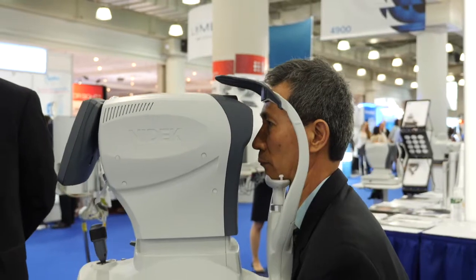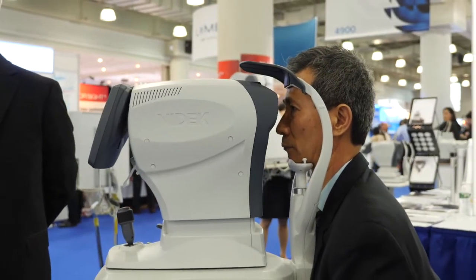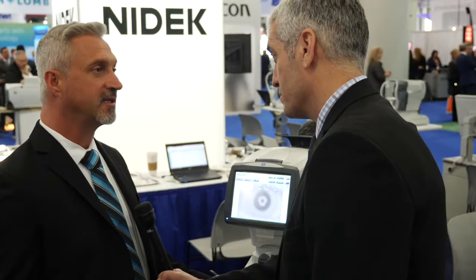Keith, can you give us a demonstration on how the machine works and why it's so efficient? Yes, certainly. As I mentioned earlier, the device itself, the AL scan, has the auto features associated with it — auto alignment and auto shot.